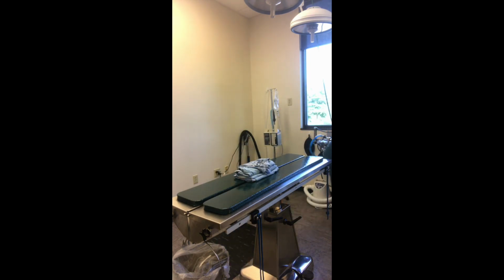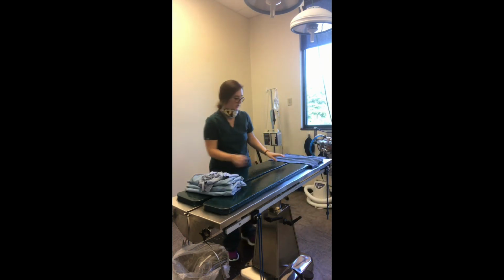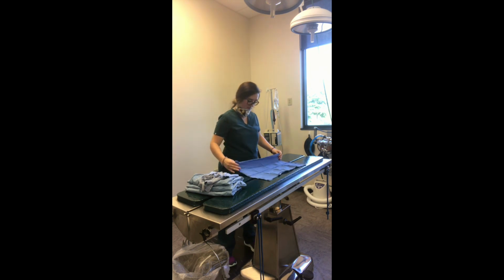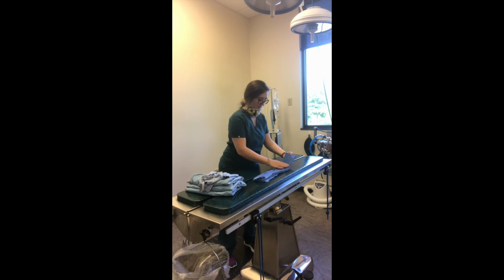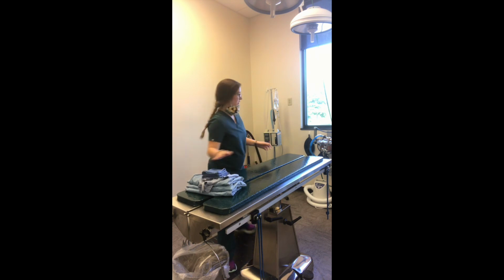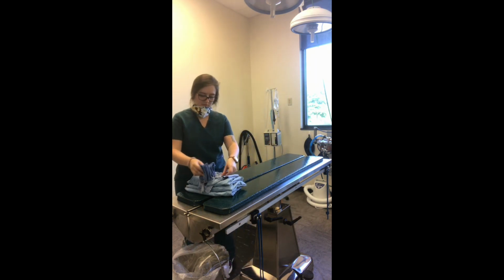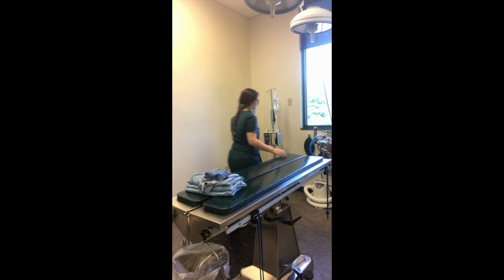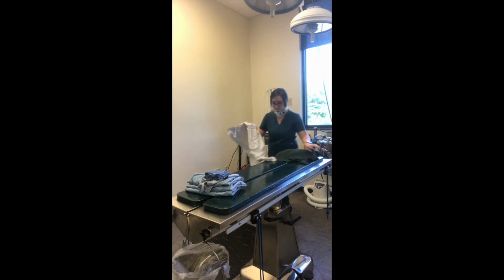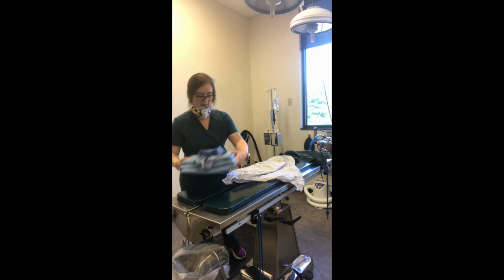And we are going to fold our towel in the accordion style and then into quarters. Place that on top. We're going to put our indicator strip in the middle. And we are going to go ahead and wrap our gown pack.